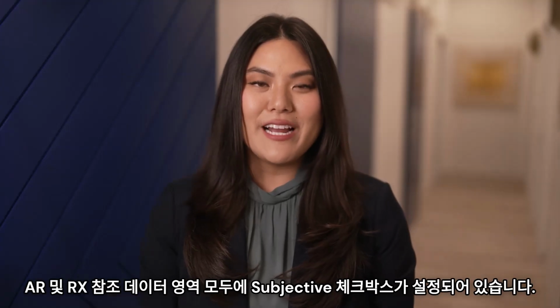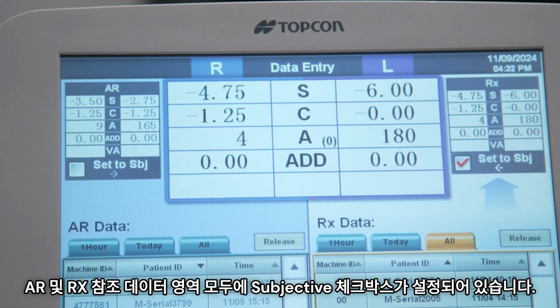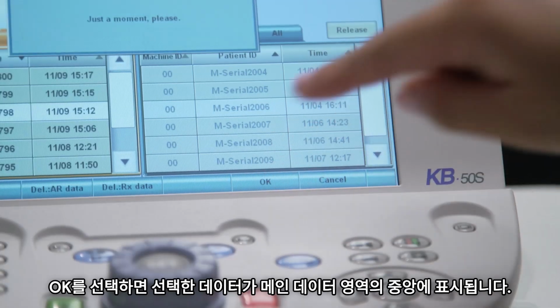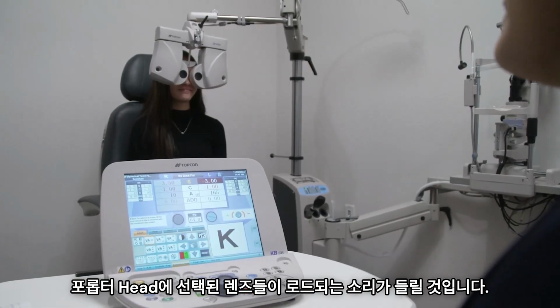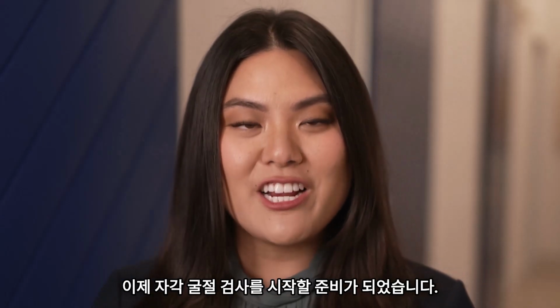There are set to subjective checkboxes in both AR and RX reference data areas. Check one of these to select which set of data you want as the starting point for your subjective refraction. Select OK, and the selected data will appear in the middle of the main data area. You will hear the phoropter head load the selected lenses. Now you are ready to begin your subjective refraction.